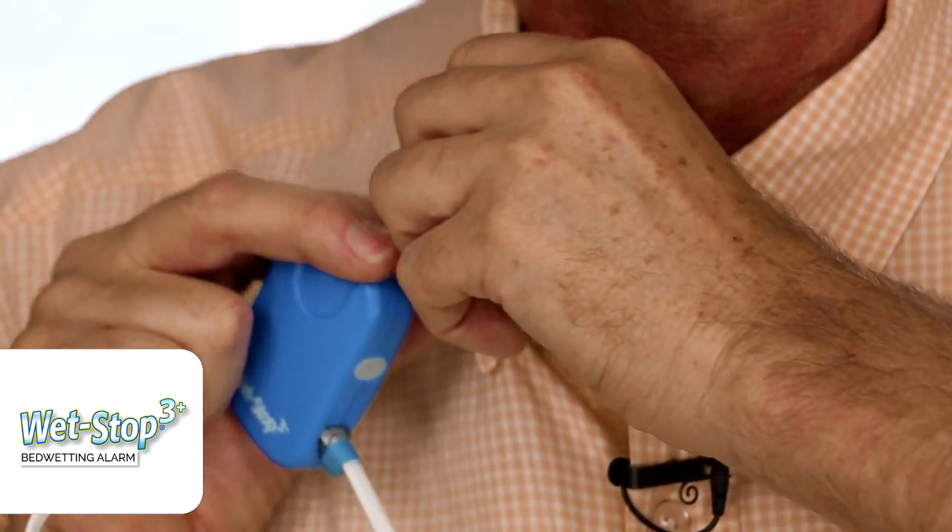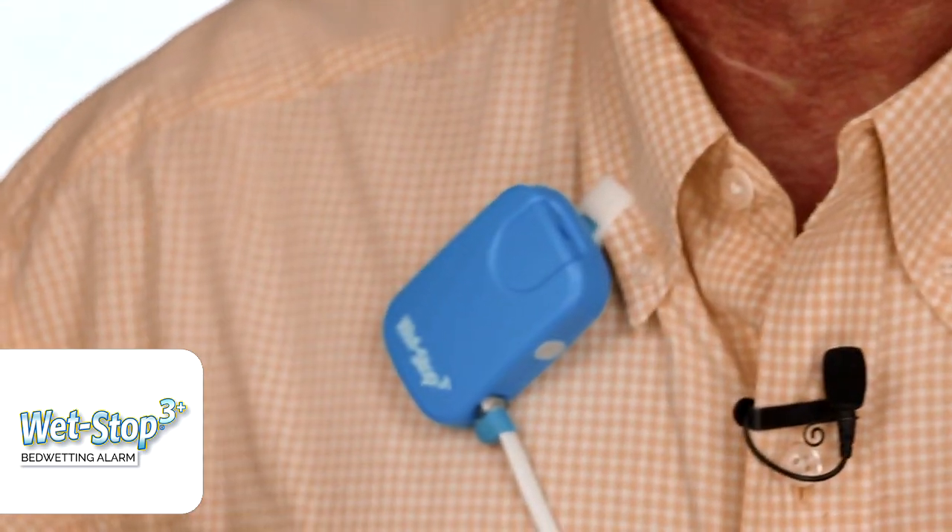After the batteries are in, simply close the battery door and it locks. You'll notice there's a swivel on the back — this is where the alarm clips to the pajama top. In my case, my shirt — you would clip it here and you can see it tugs and holds.